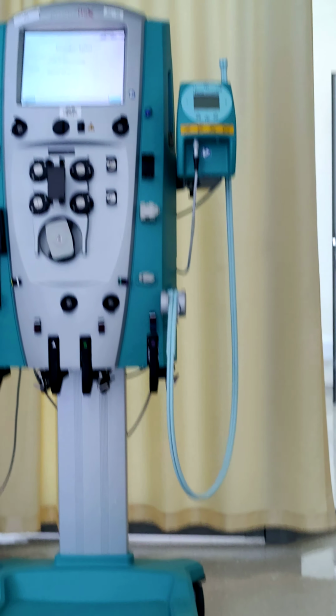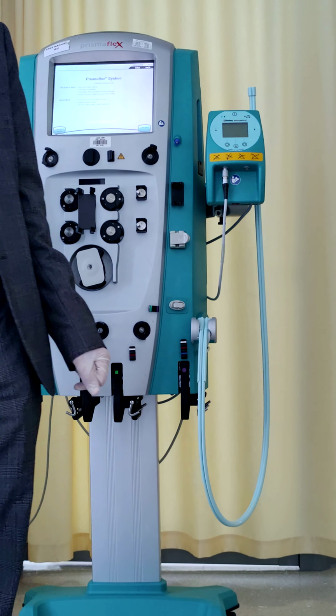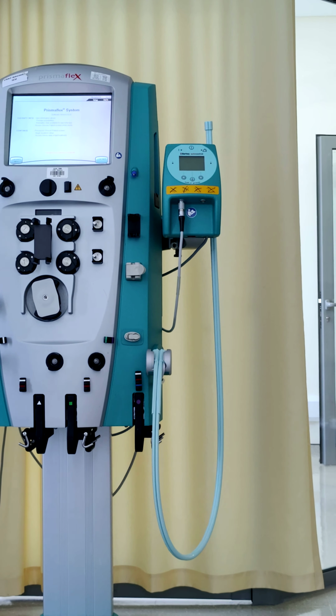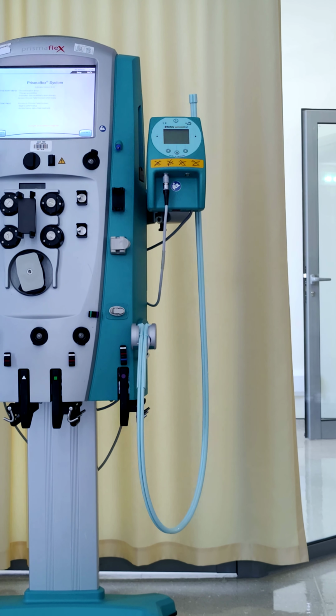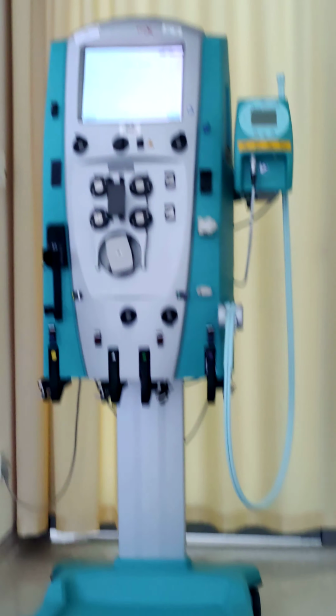Usually it's 5% albumin. But how much in ml per day, how much total dose can you give for the treatment? See, it depends on the prescription and the patient itself.